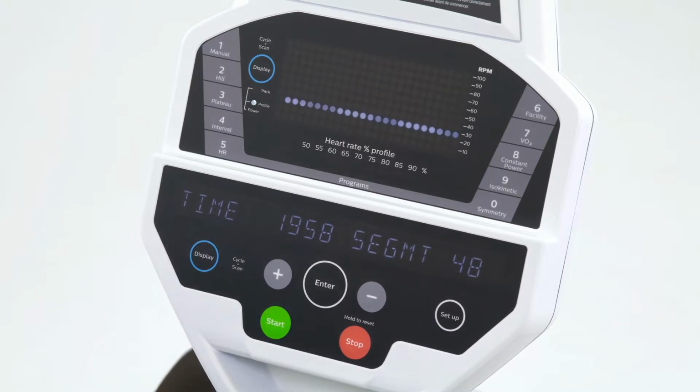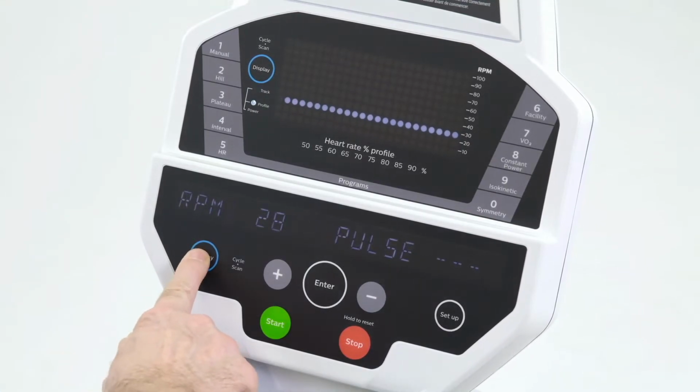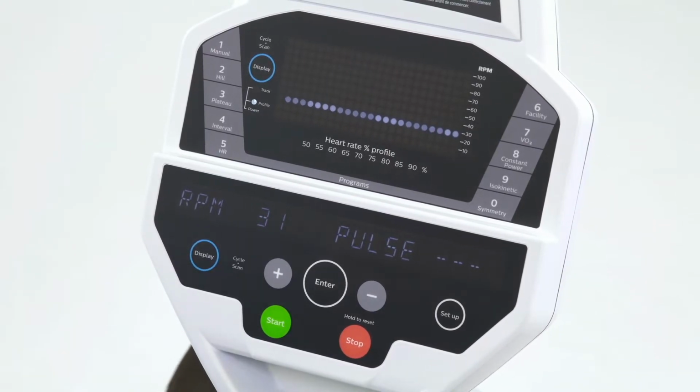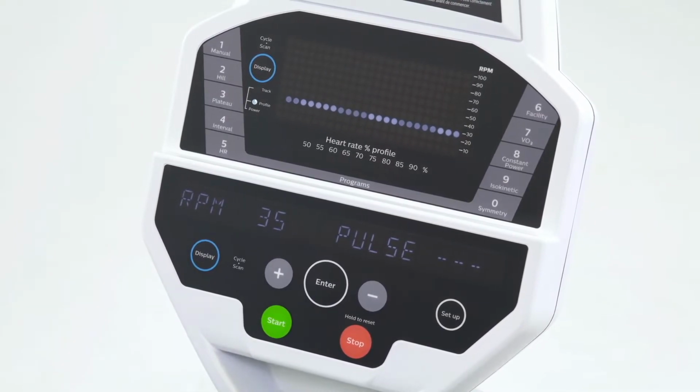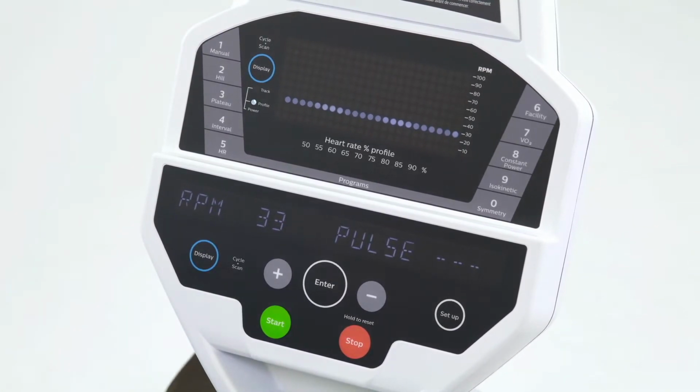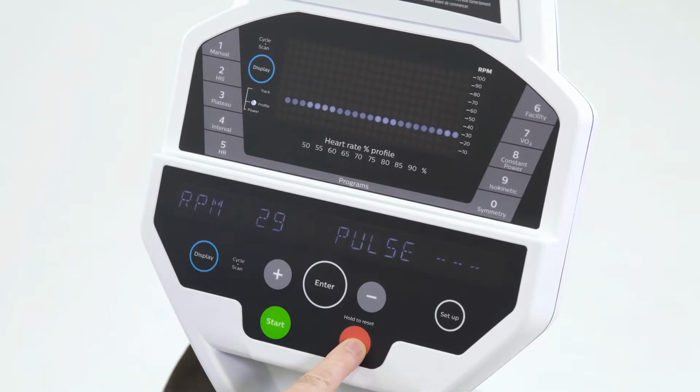So now basically I am set to 30 RPM, so below 30 RPM, I'm at 28 or 29, I get no resistance. Once I hit that 30 RPM, that resistance starts to increase, and I can push against that resistance really hard and increase my power without overcoming the speed. So those are the three different modes of resistance.